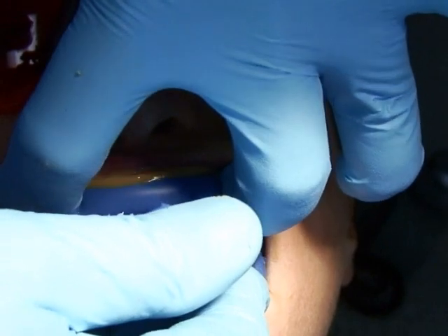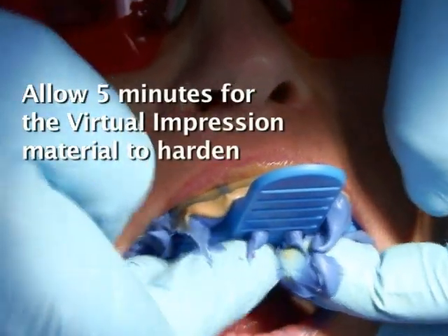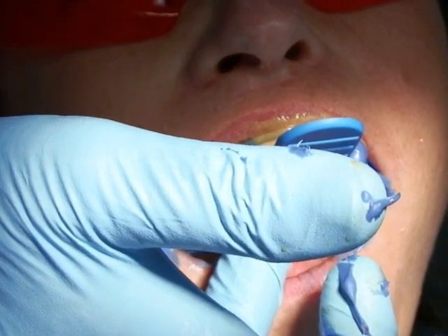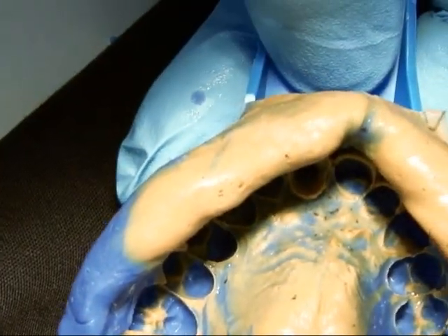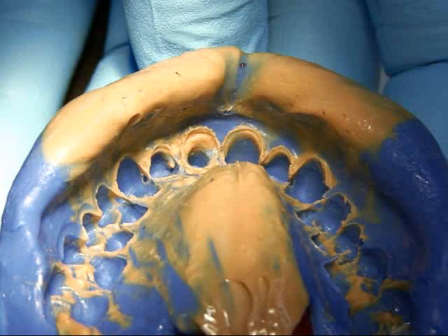We're now inserting the tray. Make sure you go straight up, pull the lip out and around so you don't trap air, then hold this for five minutes — this is the regular set; there's also a fast set, but I prefer the regular set in these cases. When you take it out, go very slowly. With cord and laser troughing, you don't get the same flash you normally would. It came out great — we just did the two front teeth with the cord packing, and I hope you enjoy this.